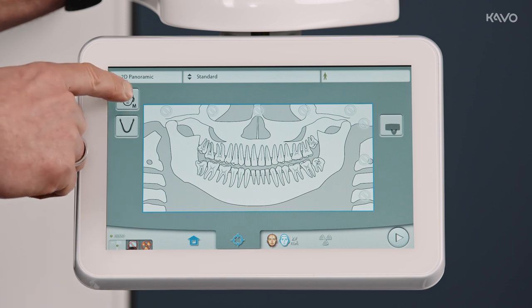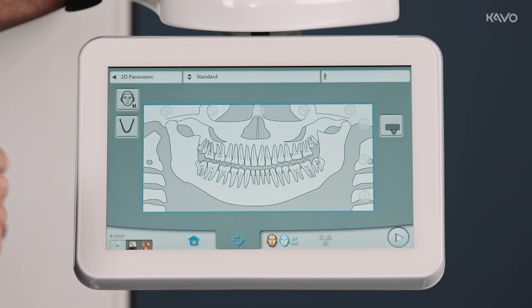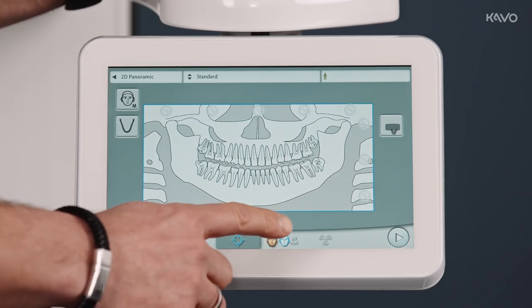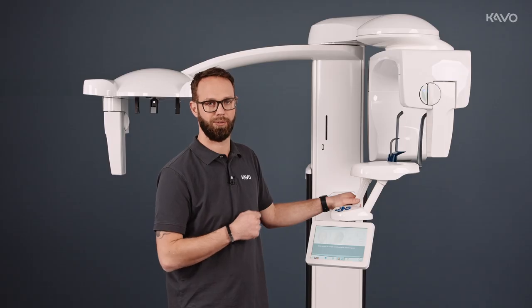The button for patient pre-selection is at the top. Here we can choose which type of patient we are X-raying. Finally, we go to the positioning level to call the patient into the X-ray room and position them correctly.